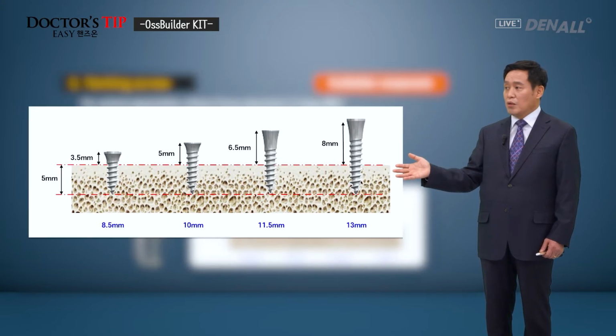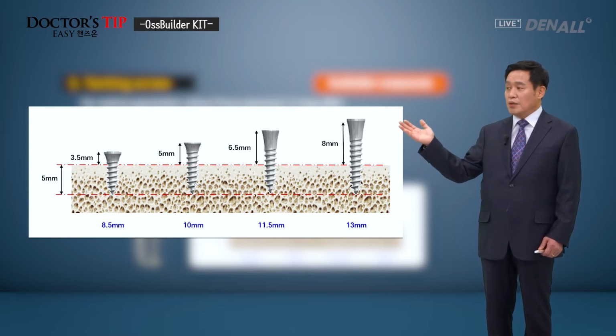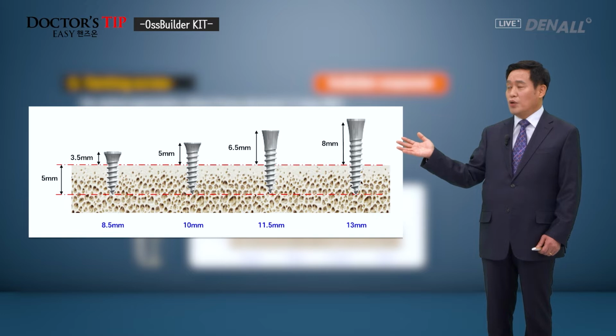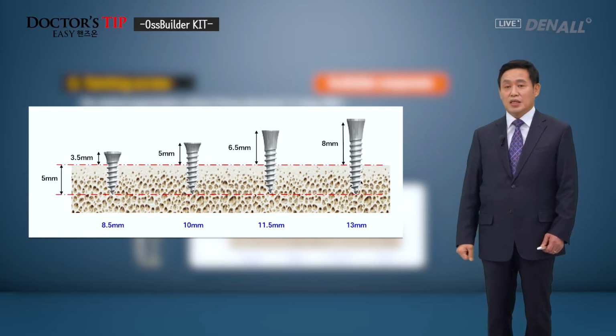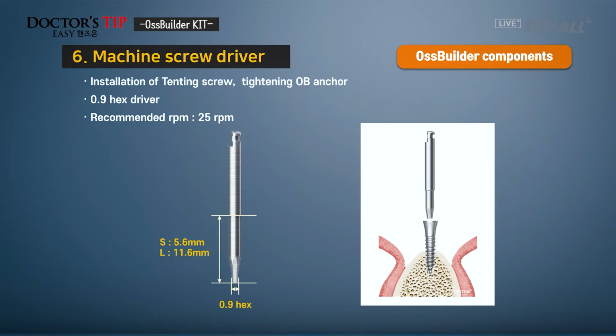Let me give you an example. If you use an 8.5 millimeter tenting screw and drill 5 millimeter, you'd get 3.5 millimeter of augmentation. If you use a 13 millimeter tenting screw and drill 5 millimeter, you'd get 8 millimeter. If the bone is very hard and you just drill 3 millimeter, you'll be able to do more augmentation. But basically, if you use a 13 millimeter screw and drill 5 millimeter, you get 8 millimeter of vertical augmentation.